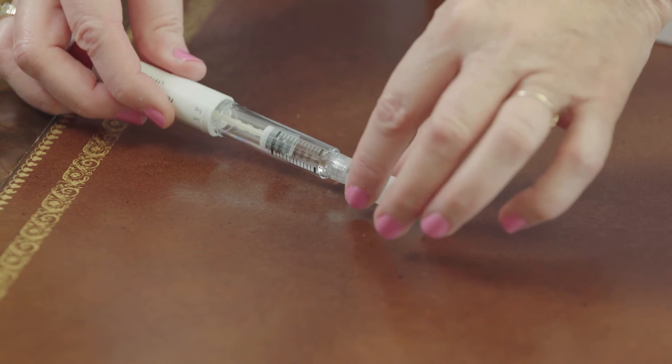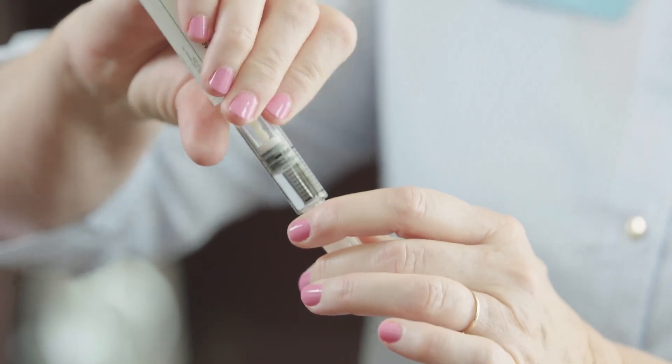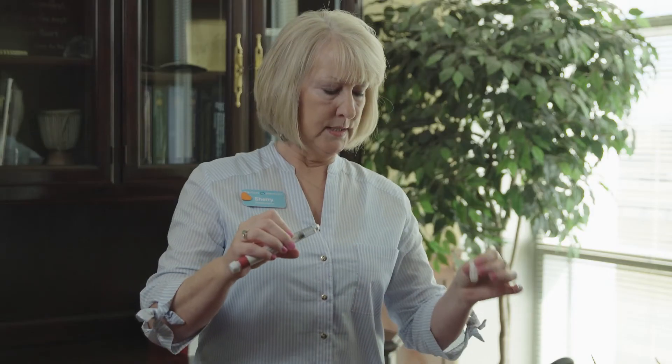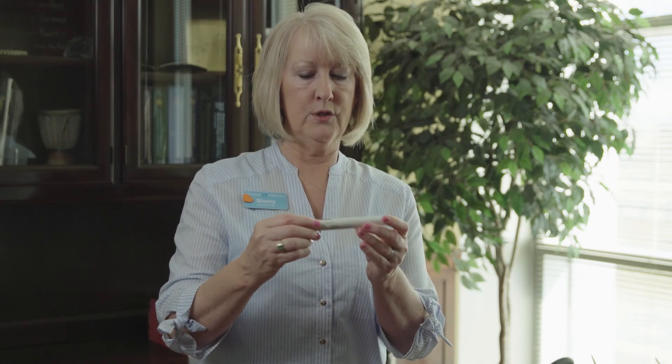To recap your pen needle, you are going to carefully insert it into the large cap and push it on tightly. Unscrew the needle and discard it in the biohazard. Then recap your pen. You can leave it stored at room temperature until your next injection.